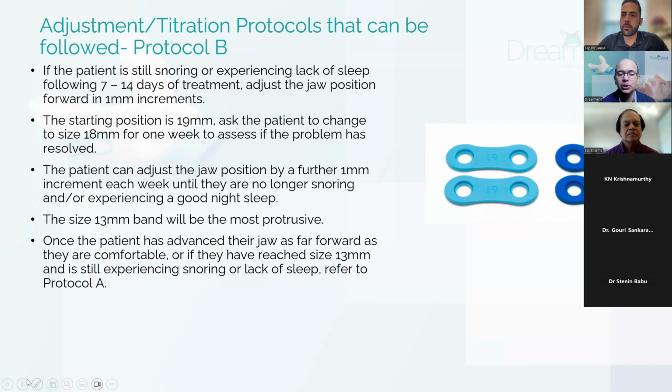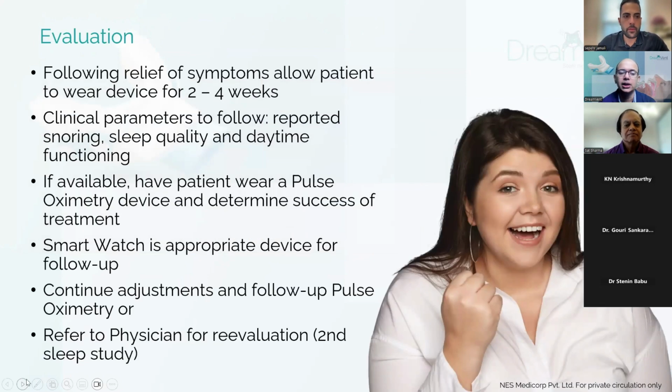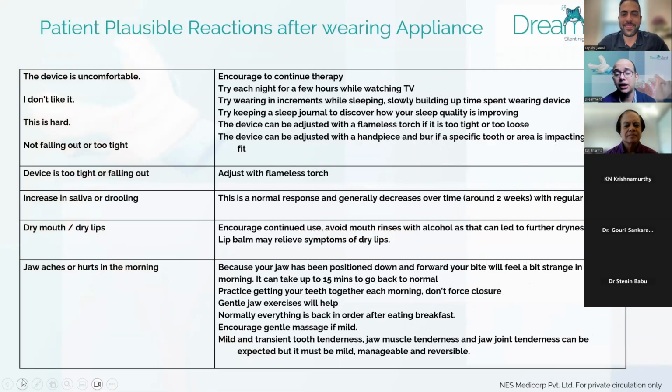And I think we'll be sharing the detailed FAQs as to how to titrate and all of that. So I'm sure that our dear dentist is sensitized to something. And many people are already practicing this and that's a good thing. But I would like more common people to understand that this is a problem. Yeah, and you've got to treat it or else you're going to have bigger problems.